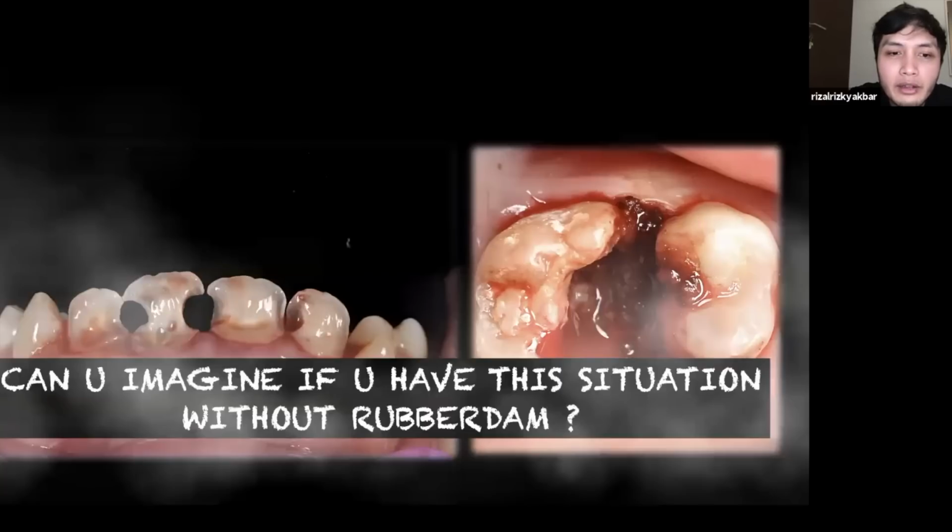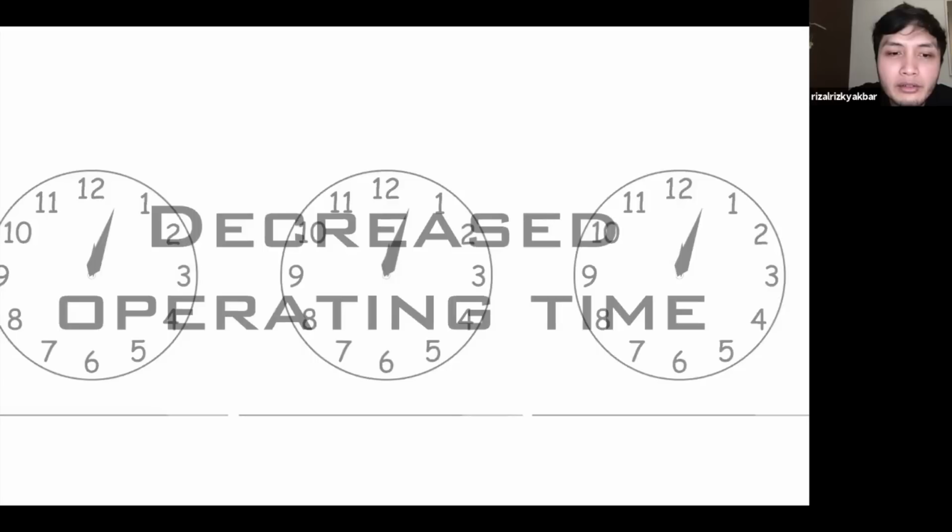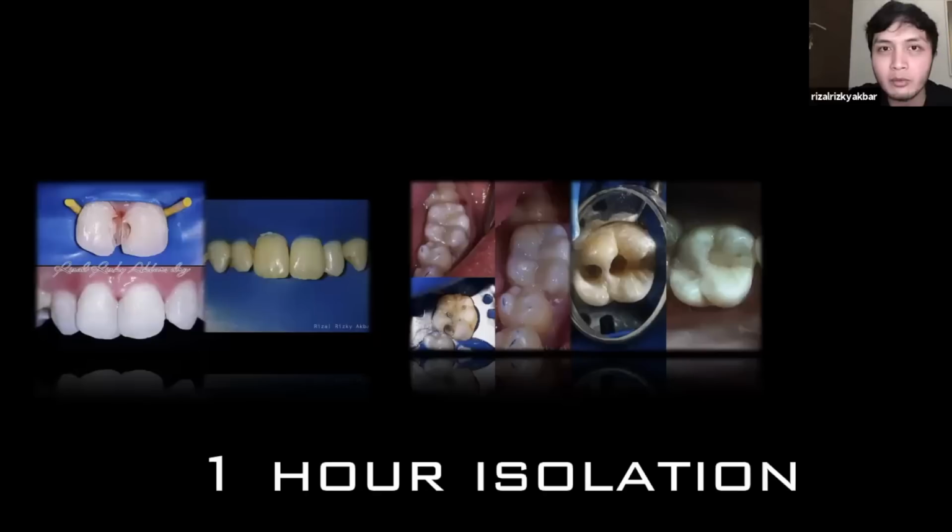And then the D is decrease operating time. I know, back then when I was a beginner, when I used rubber dam, it took me maybe 1 hour for isolation, especially for the class 2, for the posterior. I know the posterior rubber dam is really challenging. It's really a nightmare. But for anterior, it's really easy to do. But I think it's a problem of time. After you have a lot of experience, you can place rubber dam as fast as you can.